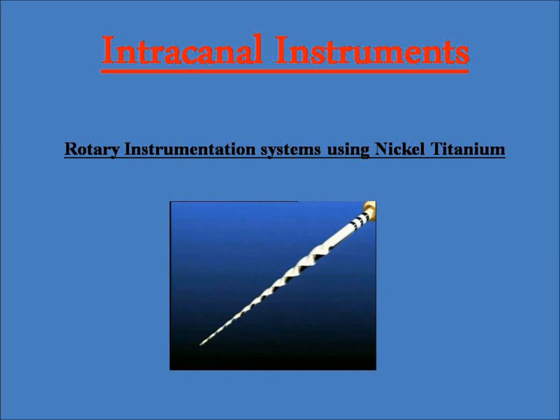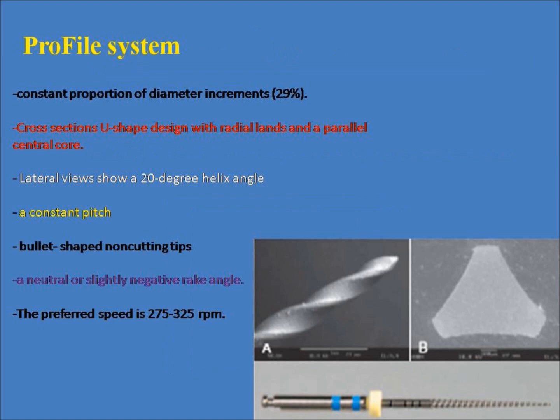Intracanal instrument. Group 3: rotary instrumentation system using nickel titanium. Profile system. The Profile system was introduced in 1994. The Profile instruments have increased tapers compared with conventional hand instruments.